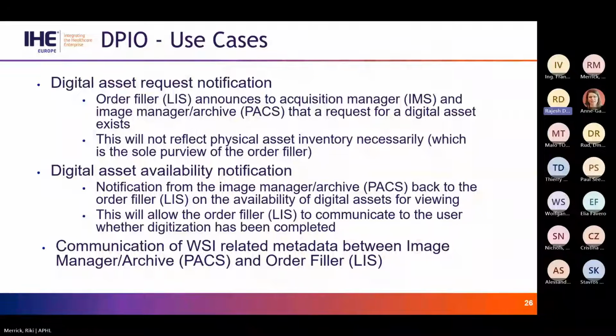One transaction is necessary to announce that there's a request for a new digital asset, and then the other one is to actually recognize that the asset has been created and is available for display to the user. And there also needs to be communication for things like the stain and other things.